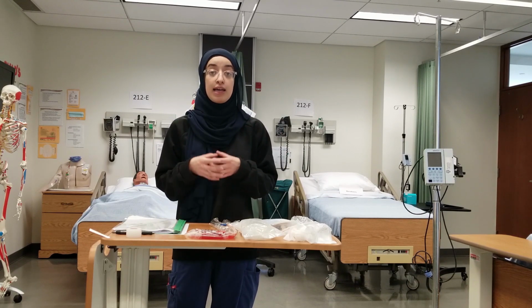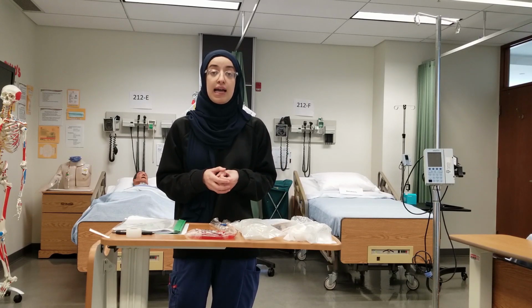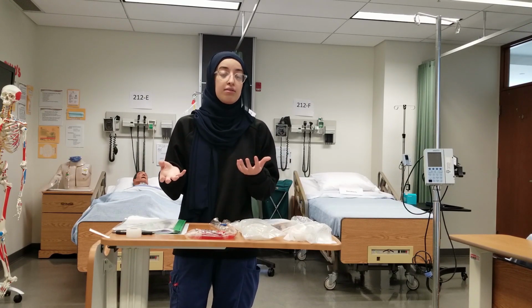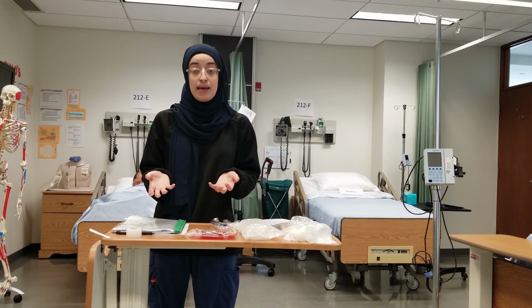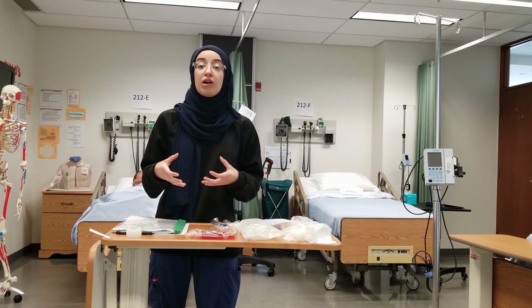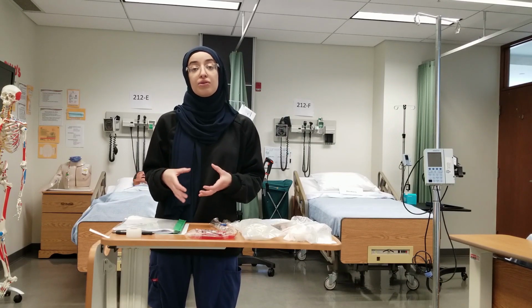And if we give that amount of fluid, specifically blood, through a very small space, it's going to hemolyze and those red blood cells are going to break. Then there's no point in us giving that blood because it can't be used by that patient. So it's super important to use a large gauge needle. If you're on a floor and it isn't typically an emergency situation, sometimes we may not use an 18 gauge needle.